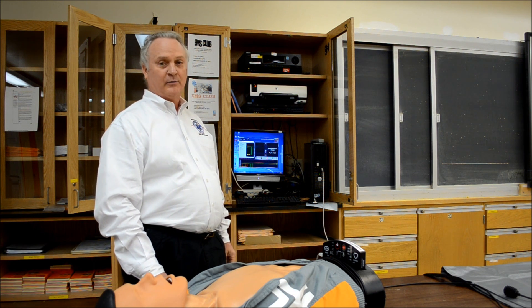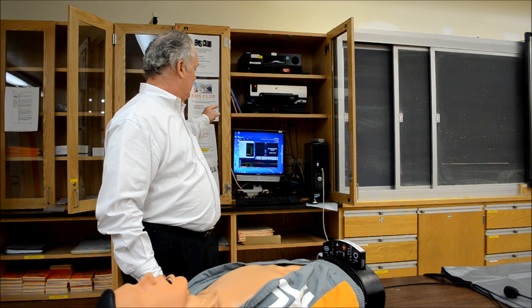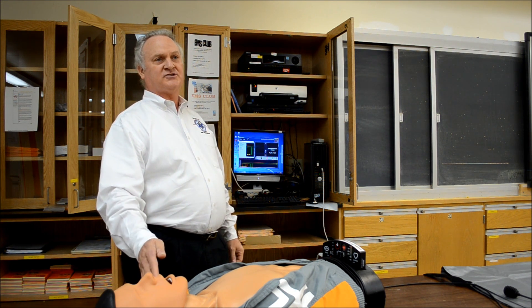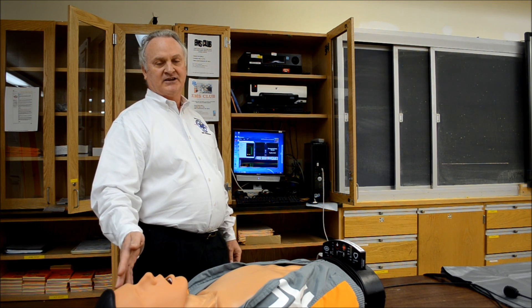We've added to our cutting-edge program the Ambu SmartMan. This model here is an Ambu Airway SmartMan. We're able now to use muscle memory in intubation, CPR compressions, and ventilations.